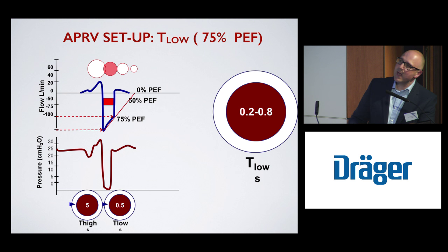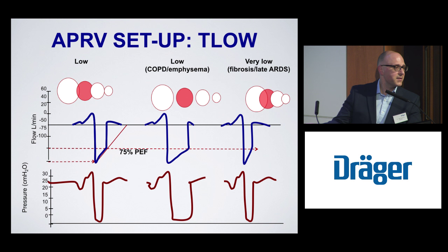So I'm just going to explain a little bit of this. This is my diagrammatic drawing. If you think about a very stiff lung here on the right-hand side, then what you have is a very steep expiration.